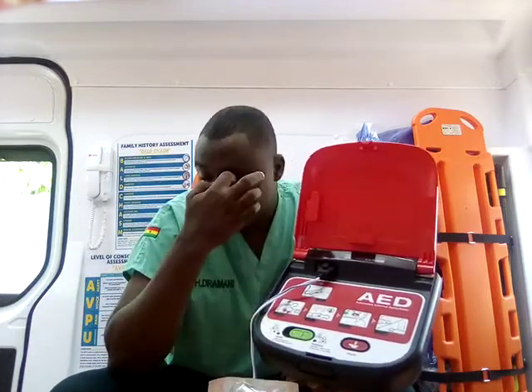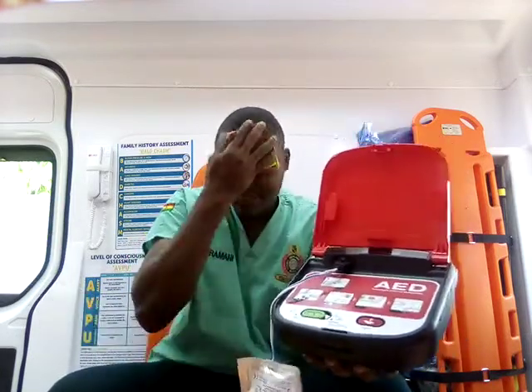Now, the reason why we are advising that: assuming you are working on a pedis and you accidentally shift it to the adult, you are going to provide more joules than expected. So we have to be very, very extra careful. And then these are the 5 steps you are supposed to follow: taking off the clothes from the patient, inserting the pads firmly, then applying the pads to the appropriate location of the chest, either for pedis or adults, and then it analyzes the heart rhythm, and if it advises you to shock, the shock button blinks red in color. And then before you press the shock button, you need to make sure nobody is close to the patient. You yourself are going to press the shock button, you are not touching the patient, and then you commence with CPR.